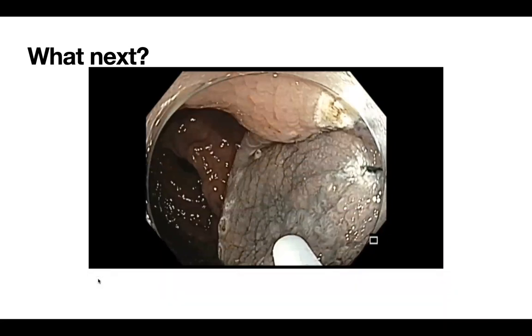It's hard to tell because you didn't let us use our reading glasses by having a magnification zoom and NBI, so I'm having a hard time looking at it. It has the O sign, so that is like hyperplastic changes there.